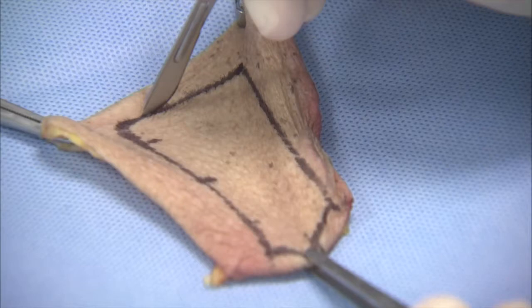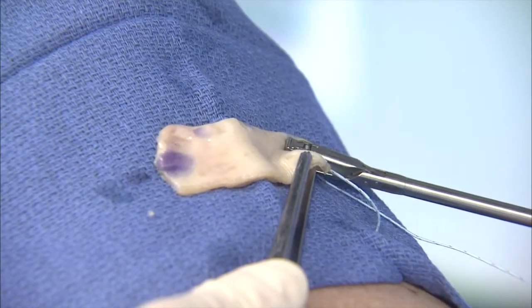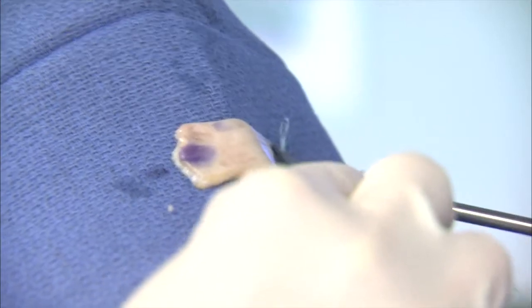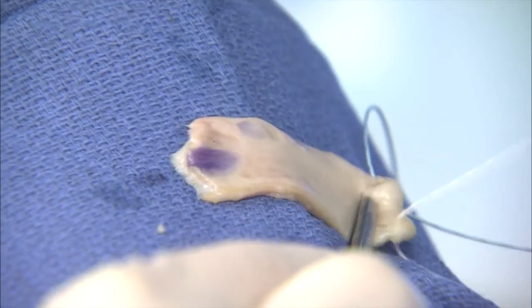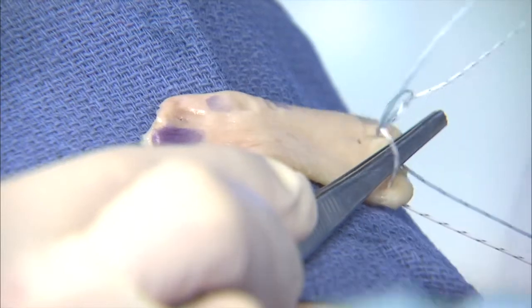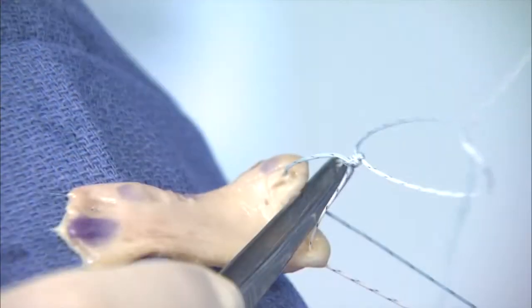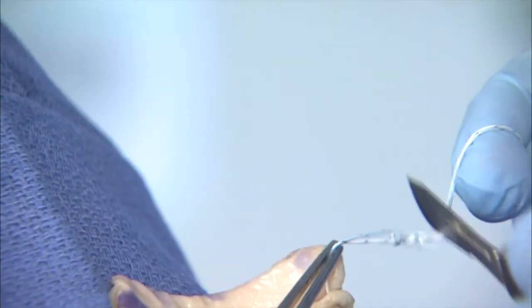The graft is prepared on a back table, sized and trimmed according to the previous measurements. The medial edge is marked with a marking pen for future identification. The medial fixation is accomplished through a double pulley technique by passing one limb from each suture anchor through the medial aspect of the graft outside the shoulder. These limbs are then tied together over the pickups.